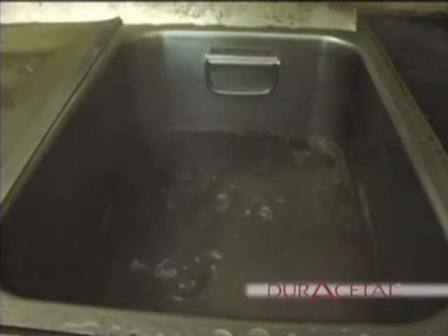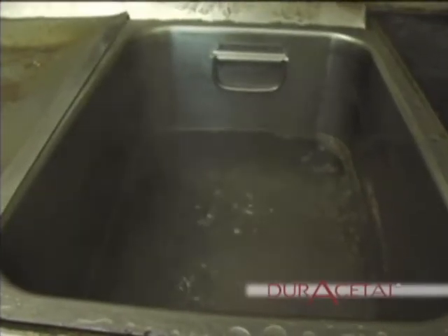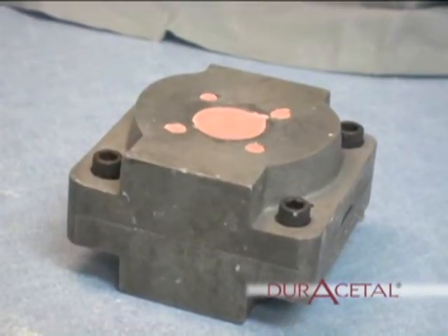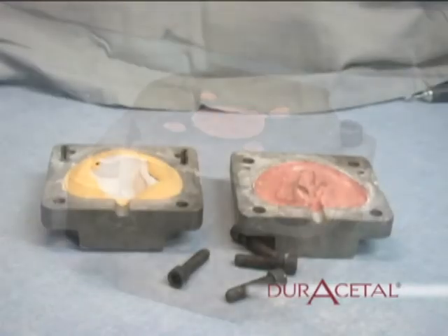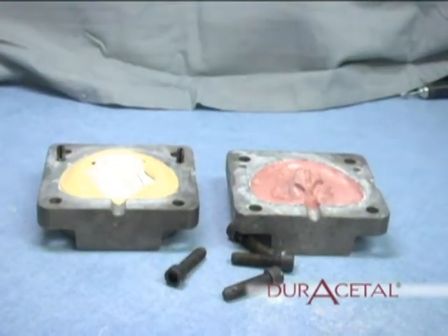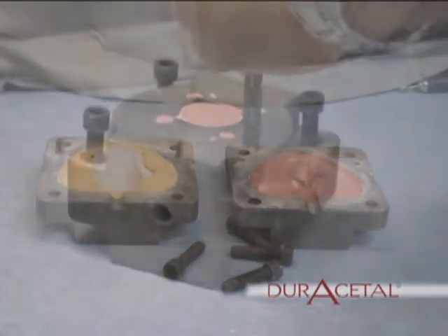Boiling out. Once the stone has set, place the flask in boiling water for about 10 minutes. After boiling is completed, separate the flask and eliminate all wax and trim any flash that could break off and mix into the appliance.